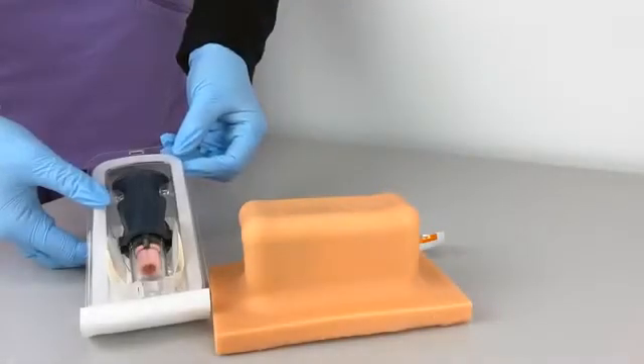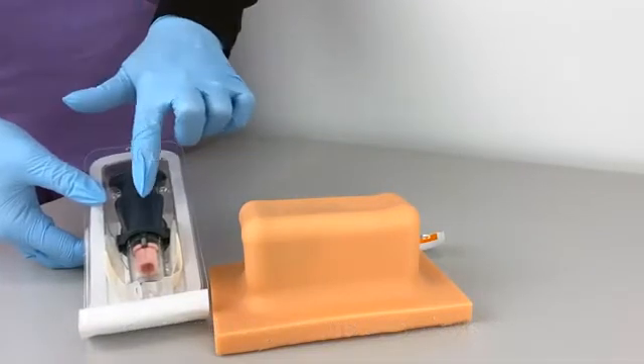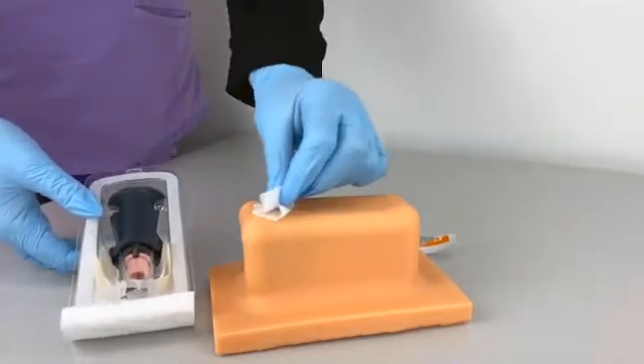The NEO infant is a manual intraosseous device intended for patients 2.3 kilos (5 pounds) up to three years of age. Inside the blister pack is a NEO device along with the fixation dressing.